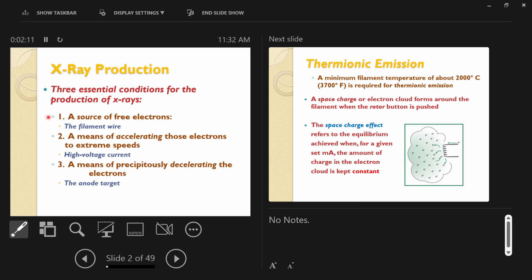When they move, when they shake, when they are caused to move fast and then slow down, or if you just were to sit there and shake an electron, again in thought experiment land, it's going to vibrate and wiggle the electric and magnetic field. It's kind of like a buoy in the ocean, right? A buoy moves with the waves in the ocean, but you could also take a buoy and move it up and down in the water, and it would create waves in the water, okay? The electron is like the buoy in that case, and the water waves are like the electromagnetic waves, okay?